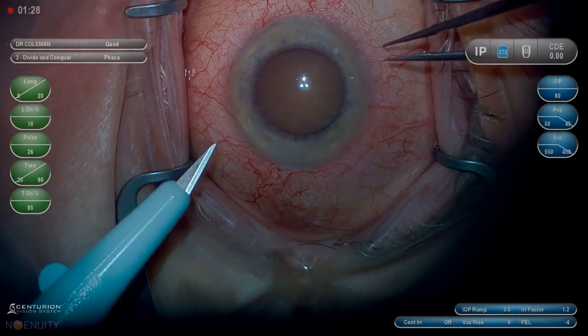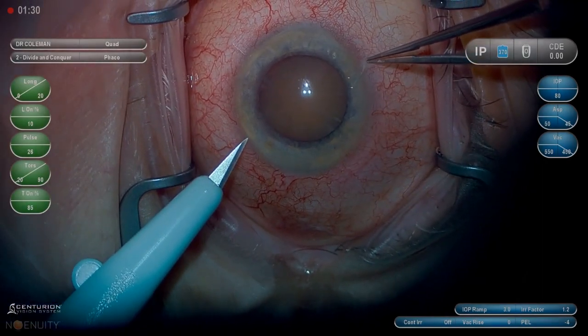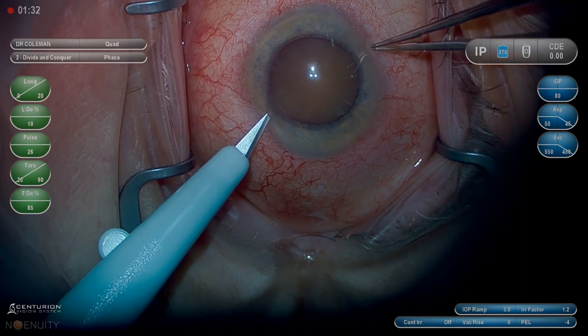This is Dr. Weich Coleman for CyberSight. This is a mature cataract in a patient with coexisting glaucoma.